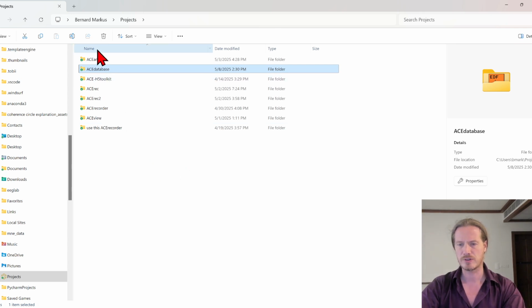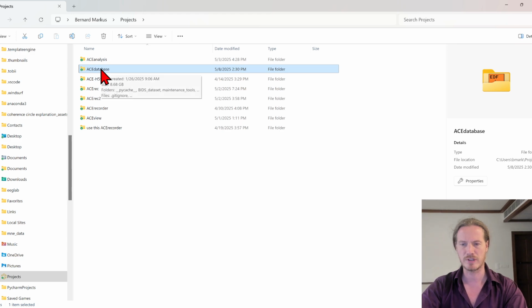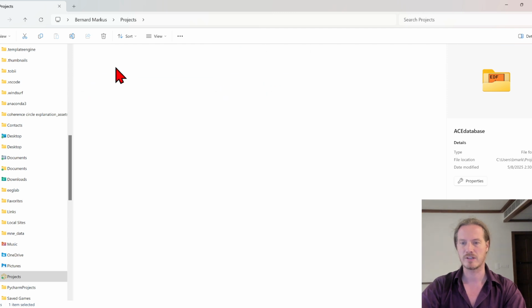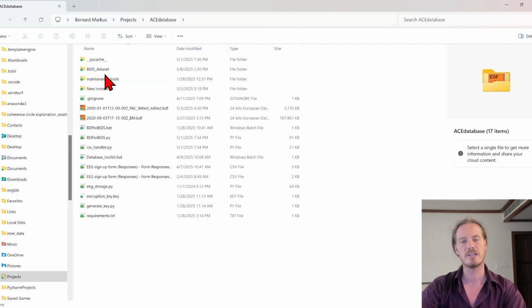So I call this ecosystem the ACE, which stands for Alpha Coherence EEG, and there is the ACE recorder, which records the EEG from the device. Then after the recorder, it goes into the database, and let's take a look at the database. In the database, the original recording gets separated to ensure privacy for the subject, so that their name and their date of birth and their email address and all of that is completely separate from the data to meet the standards for that kind of data of the US and the EU.